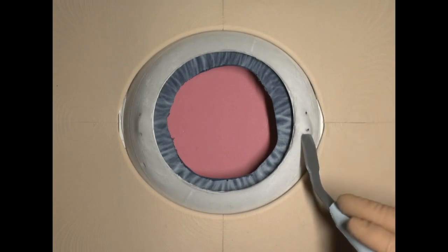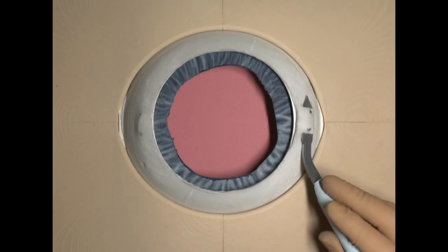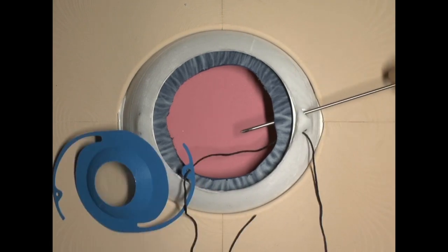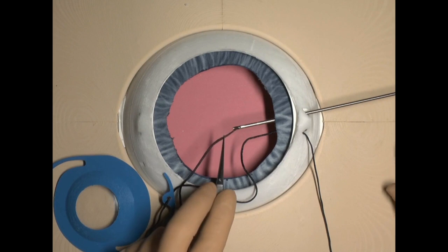For fixation by Goratex, we suggested a method with tying inside a sclero-tunnel constructed parallel to the limbus. The sutures can be let ab externo by a needle or ab interno.